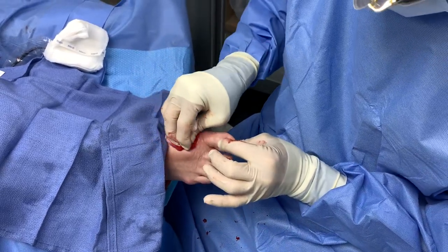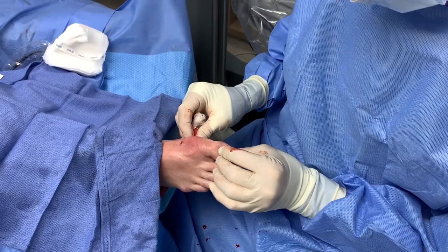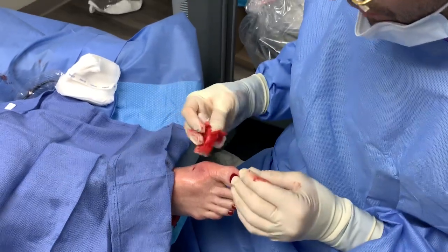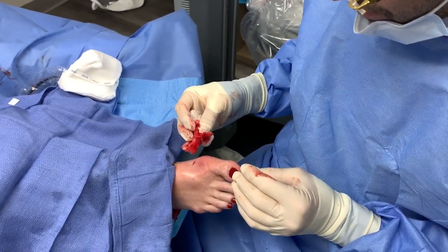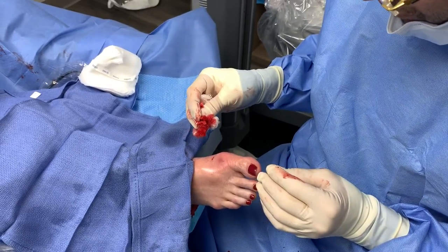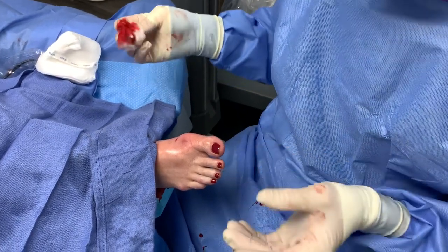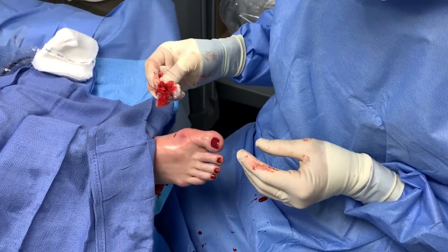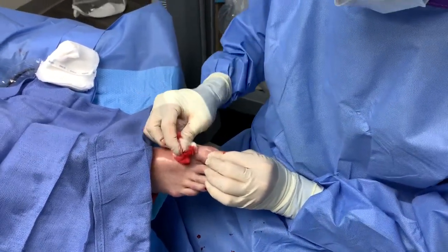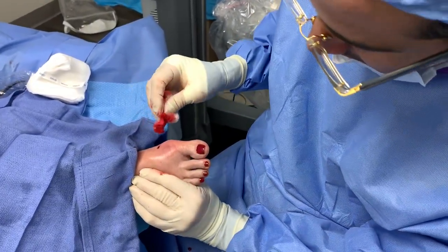So not only is there going to be pain relief, but she'll definitely be able to use the pumps that she's been wanting to wear, pain free. We're here in our office-based surgical suite. The patient is wide awake. This has been performed under local anesthesia in about half an hour. It's an extremely effective procedure, and we're going to go ahead and put one little stitch there.